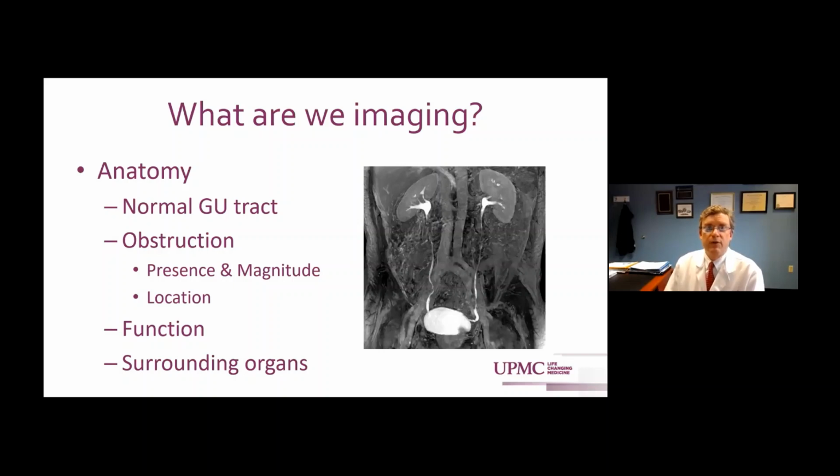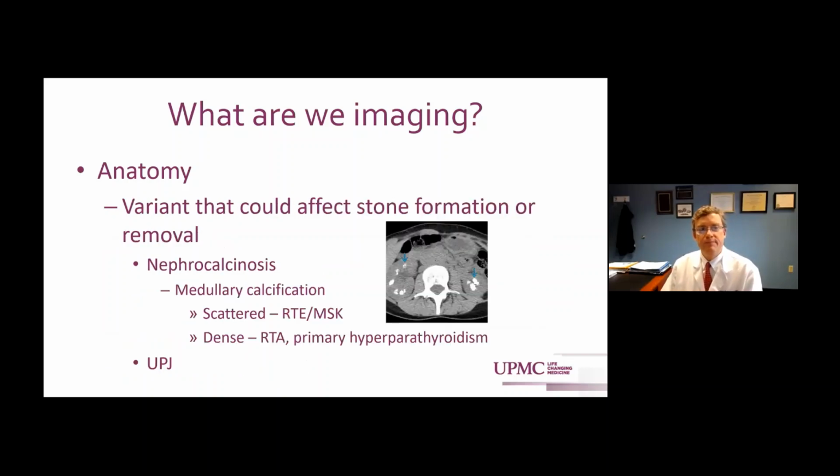And so really, with respect to imaging nephrolithiasis, you're looking at everything that's related to the nephrolithiasis that might be helpful on those studies. Some of the other anatomic variants, so getting back to the kidney, that could affect your decision, your stone treatment, or overall treatment of the patient, would include all sorts of things. I've just listed a few here.